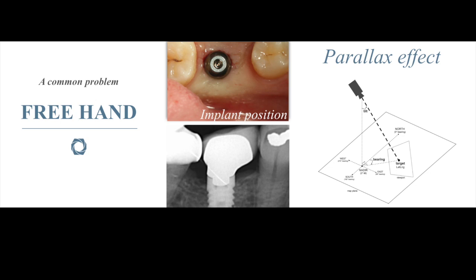Ioannis had brought to my attention something called the parallax effect. I didn't know what it was, but he explained it to me. It's like, if you're on the right-hand side of the patient, going into the left mandible, so a left molar or something, with his drill, and he wants to do his first osteotomy. And he thinks that he's in the right position. He books in, he drills in, and then looks at a different angle and can see that, I've gone a little bit more distal. I've gone a bit more lingual. So he was trying at the time when I met him in the lab to create some little tooling that he could use to relieve this stress from himself and to be able to do it predictably. And that's how the guide came to life.